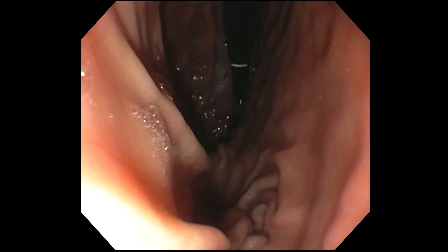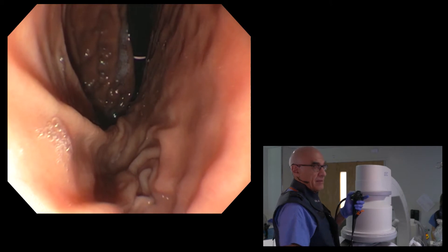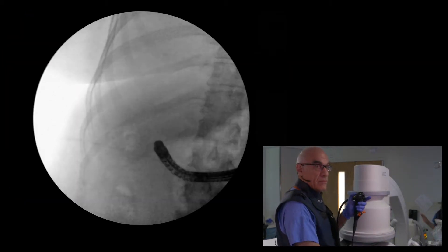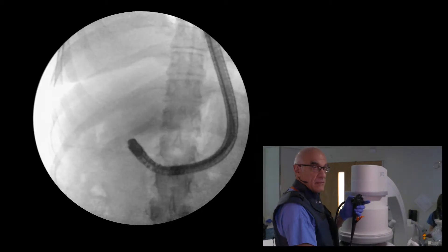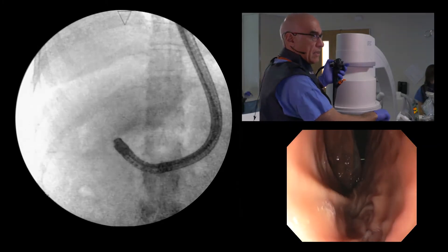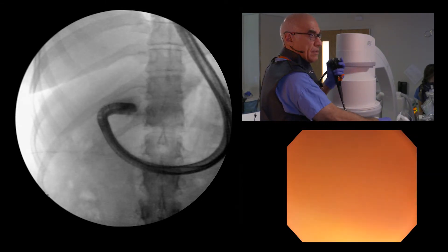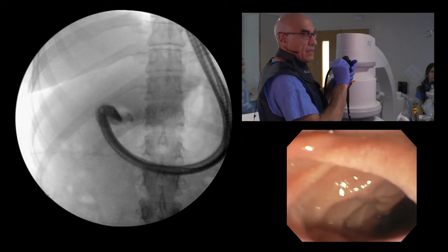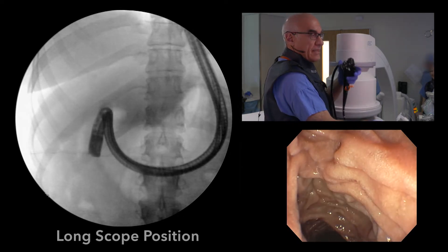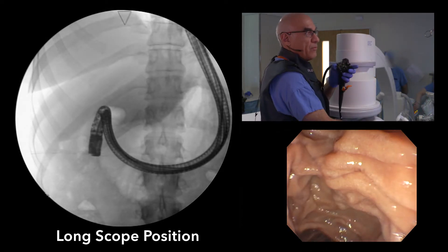And now on to the pylorus. The scope is in long position. Here I'm finding the pylorus, and now I'm in the duodenal bulb and going down. That's called long scope position, and that's a reasonable way to find the papilla.